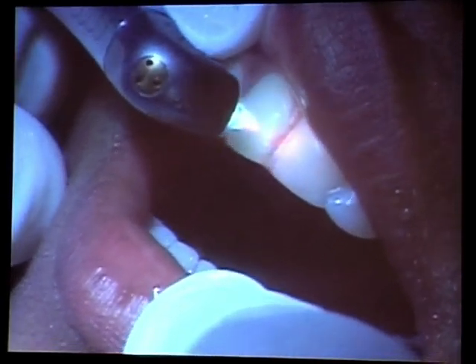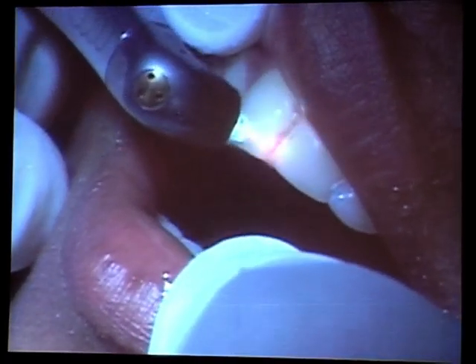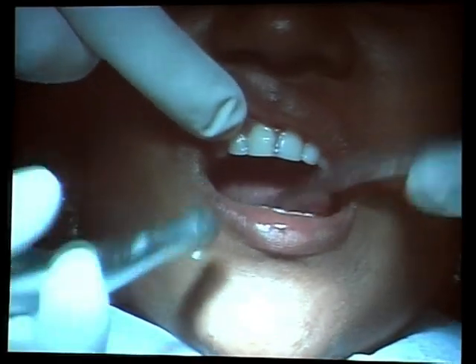And you can see how quick that is. We can go up to 8 watts with this laser. So as you can see, a little part of the filling is gone already.